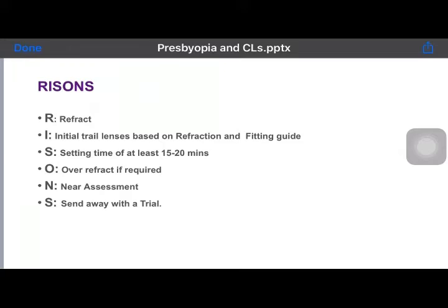Got it. Yeah, so that's the right question as well. It's a fantastic question. Ideally, the best designs in the world have a center distance in the dominant eye and a center near in the non-dominant eye. But unfortunately, in this part of Asia, we either get a center distance or a center near from one single company. If I'm not very wrong, you get CooperVision... you get SEED contact lenses in center distance and you get the Bausch and Lomb and the Cooper Vision lenses in the center near part.